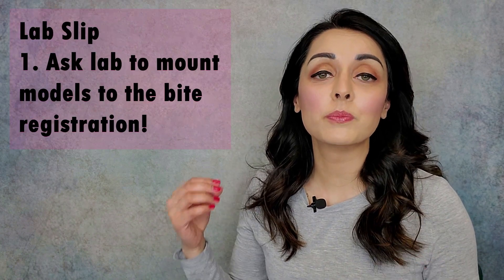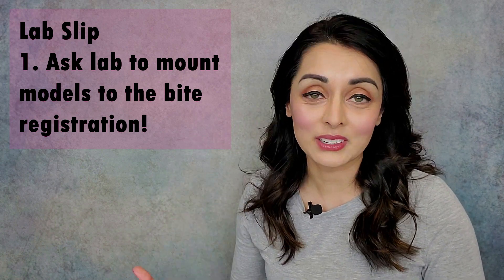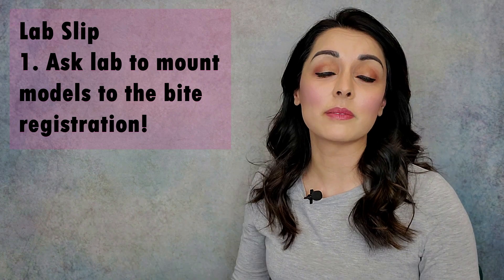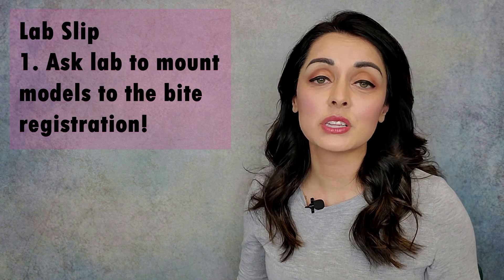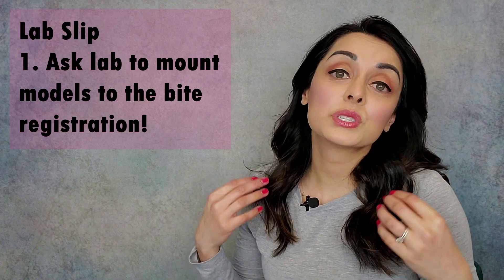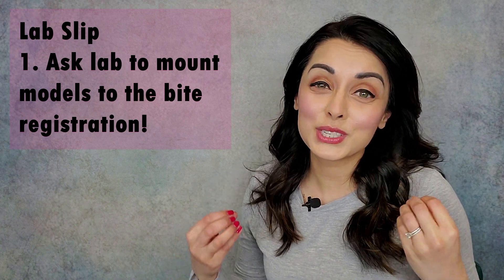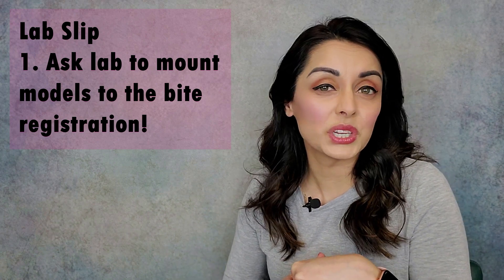That should lead to a decrease in the clicking and popping over time. Once this Aqualizer bite is obtained, which I'll cover in a moment, you will then send the bite and the models of the teeth to the lab. The first thing you want to put on the lab slip is to ask the lab to mount the models to the bite you gave them. This is crucial — this is the key, this is the whole reason we're doing this. Many labs will hand articulate the models and build an occlusal guard with that, and that is not what we want to do for these patients that do have myofascial concerns as well as joint concerns.